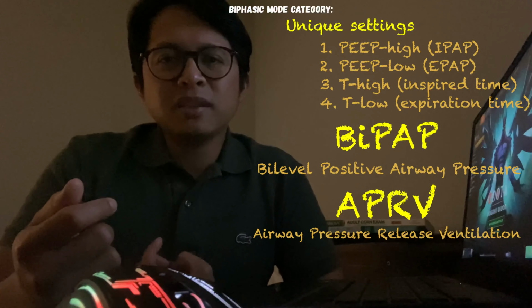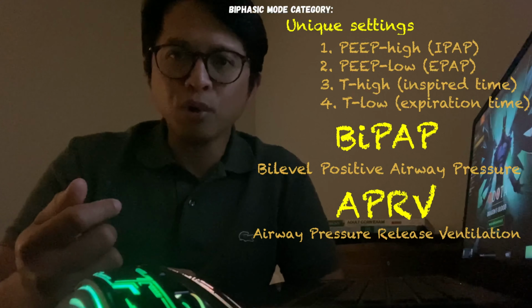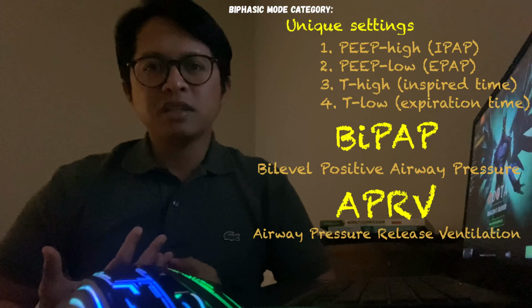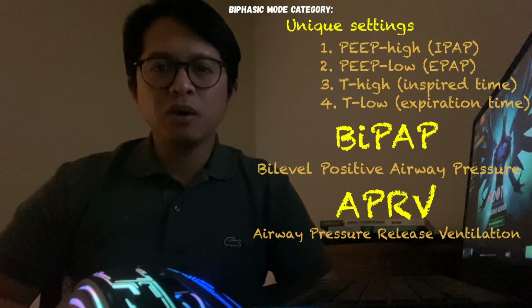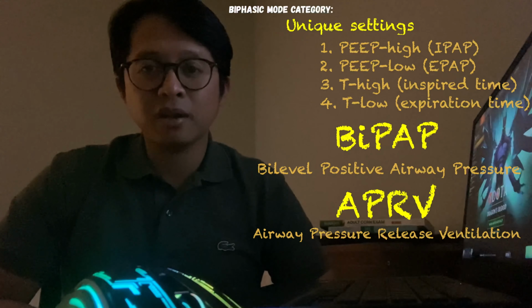Although they might have very different origins, both can be realized with the same technical arrangement but different settings. This is why some ventilators have separate BiPAP and APRV modes, whereas others have a single mode for both BiPAP and APRV.